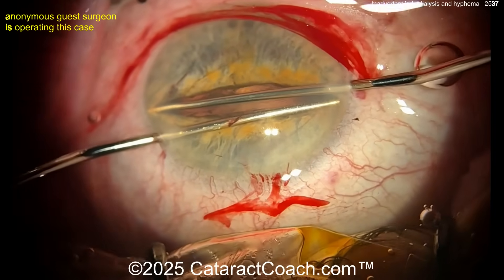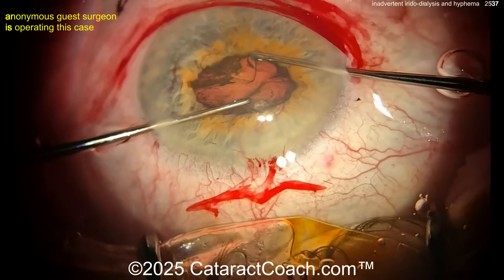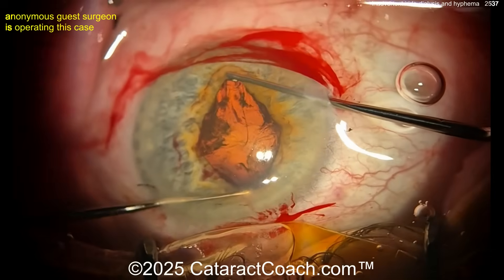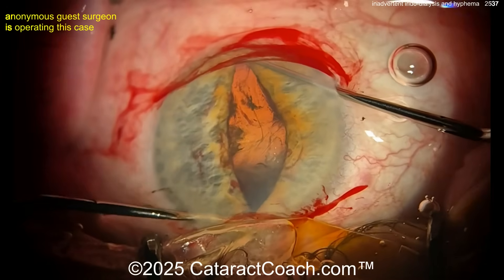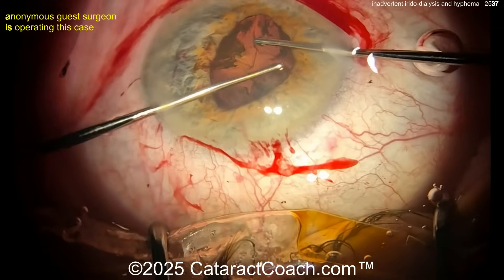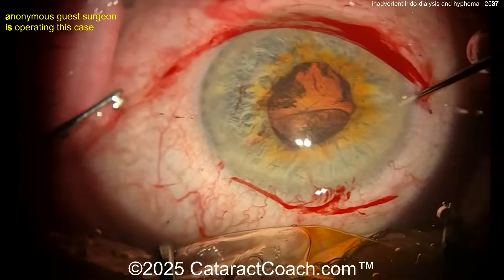There's a stretch in one direction, maybe do a little stretch in the other direction. Notice how the anterior chamber is a little bit shallow here — it's not a simple case. Pre-op AC depth is around 2-point-something millimeters and the eye's IOL power is 26 diopters. It's going to be a tough case.